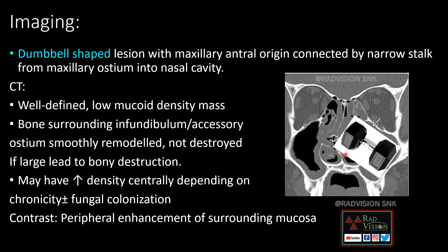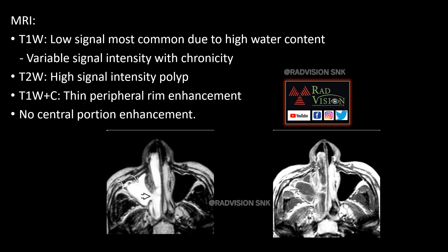If large, it can lead to bony destruction. It may have hyperdensity centrally depending on chronicity or fungal colonization. On MRI, we usually see T1 iso to low signal intensity and T2 high signal intensity. On post-contrast, we see thin peripheral rim enhancement. No central portion enhancement is seen.